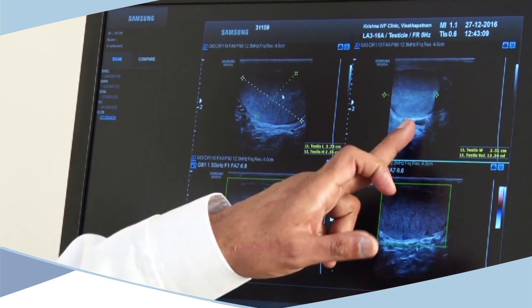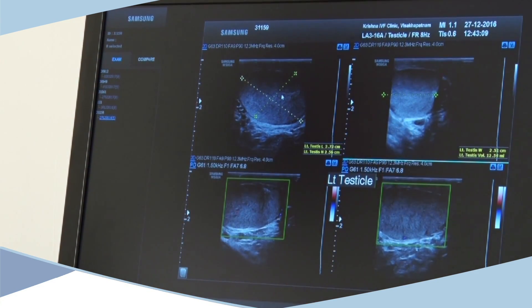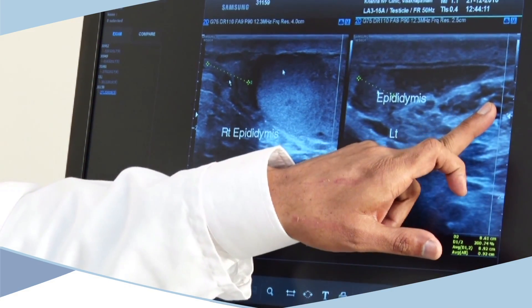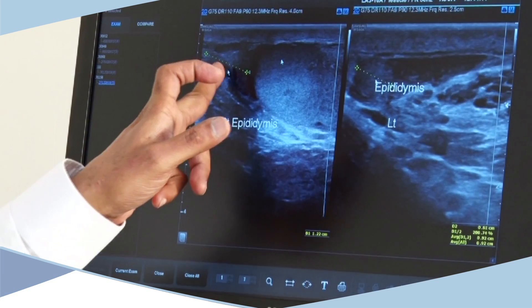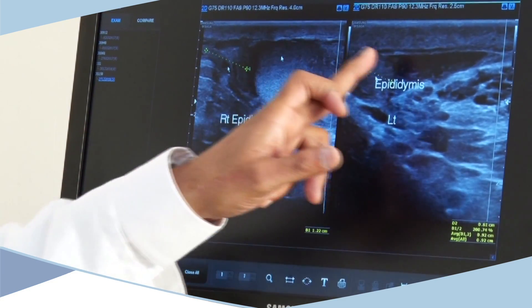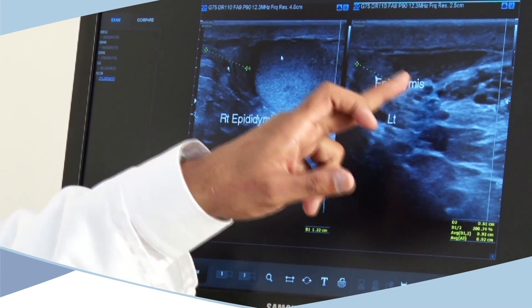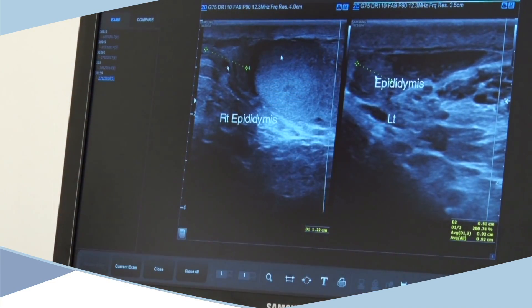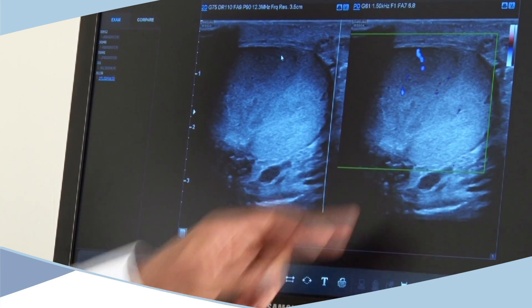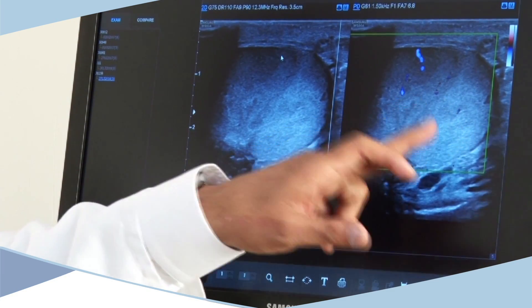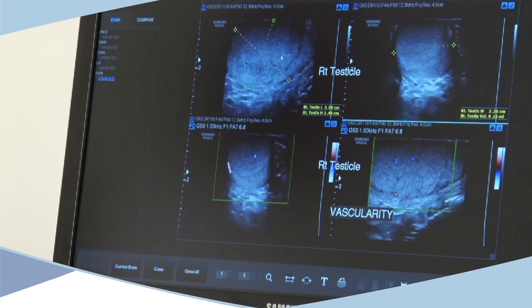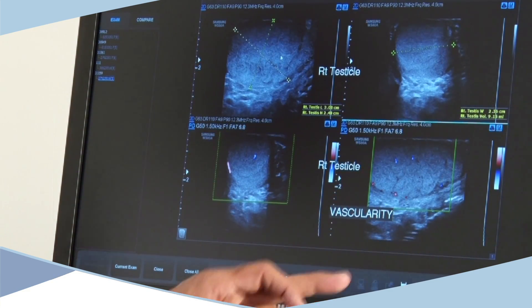Here you can see the testis in different shapes, the vessels whose diameter can be measured, and the epididymis on both the left and right sides. You can also measure the internal structures of the epididymis to get a better view using 3D or 4D scrotal Doppler, helping to precisely locate where the sperms are for biopsy.